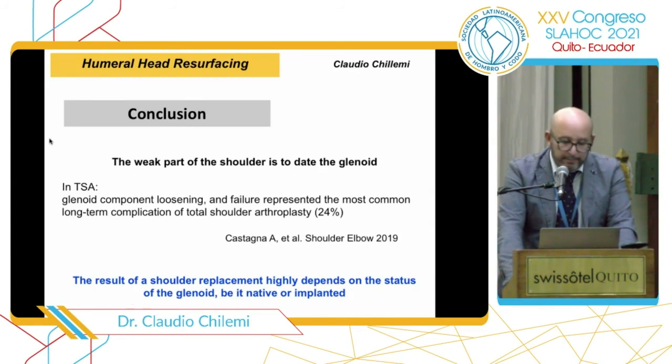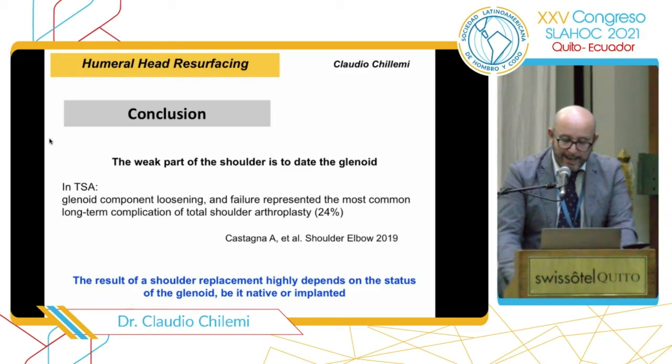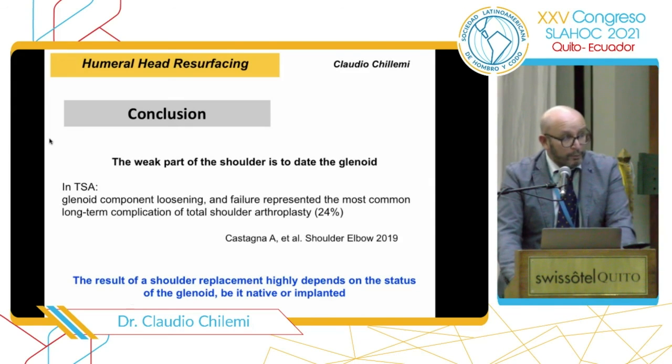If we have a look at total shoulder arthroplasty, glenoid component loosening and failure represent the most common long-term complication. And the results of a shoulder replacement highly depend on the status of the glenoid, be it native or implanted. So probably we have to work on that side.